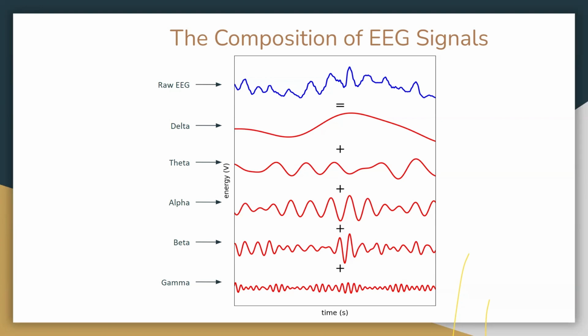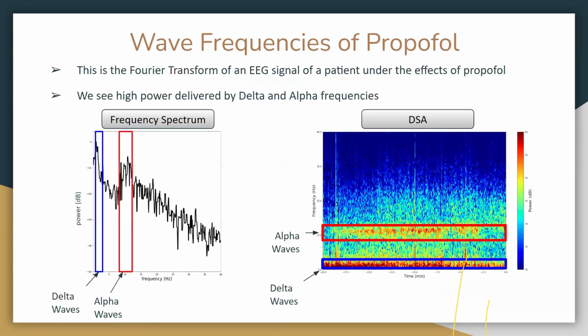It almost wasn't visible. But what you can see here is that these things all added together linearly will perfectly recreate the blue signal here. So it's exactly made up of these composing frequencies.